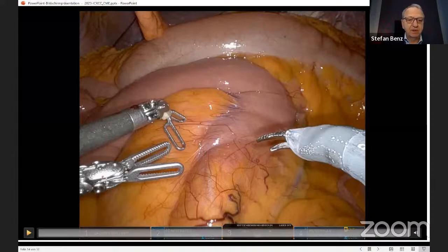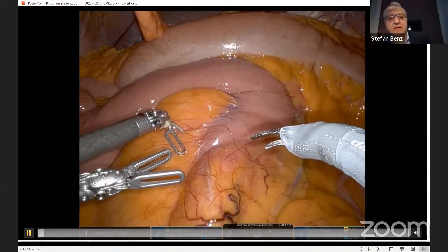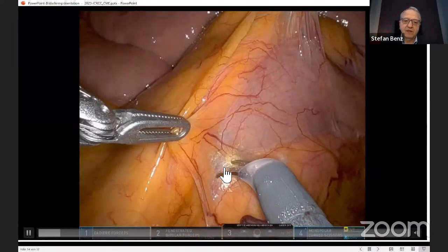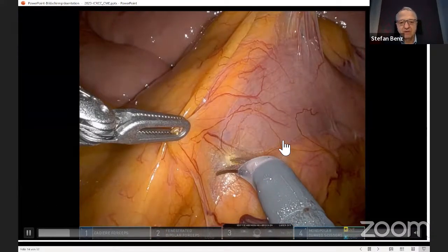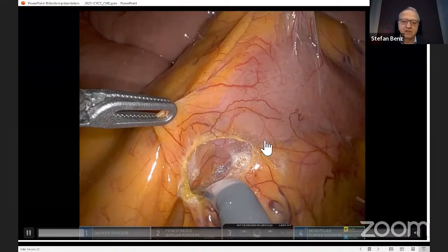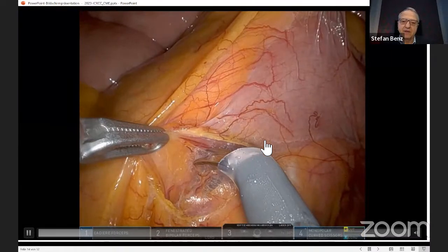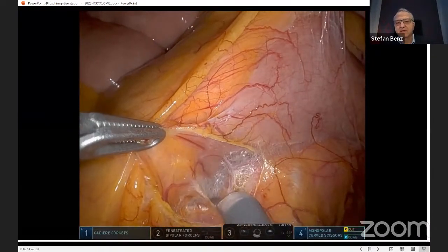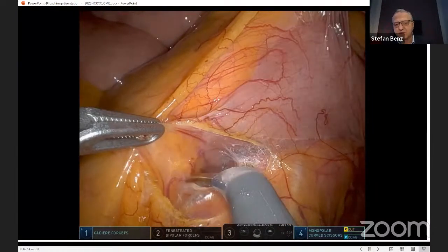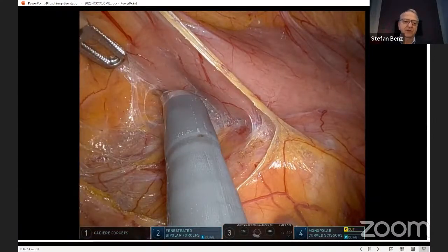And I hope the video runs smoothly. We start at the duodenum. Now the video is not very smooth, I just see. Anyway, I just proceed. And we work our way from medial to lateral underneath the duodenum and underneath the mesenteric root. We push down.